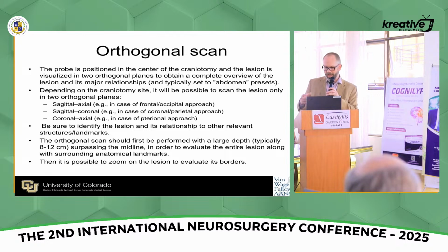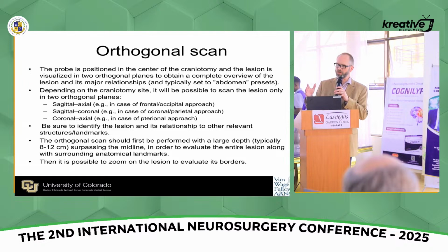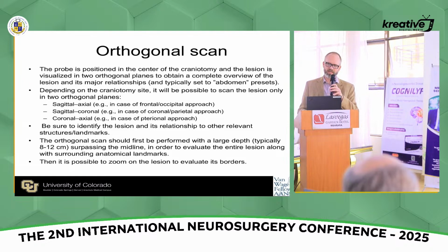And then I get a few scans during the resection if I'm doing a tumor or hematoma evacuation or an abscess, let's say, drainage, and then a scan at the end, post-dural closure, to get a nice control ultrasound to make sure you don't have any post-operative complications like a large hematoma in the cavity. So I've just said all these things basically just to save us some trouble.